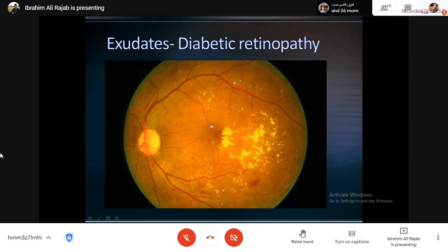We have 3 or 4 causes of dark macula. Thank you Amin. Because there is a high concentration of photoreceptors here, and there are pigments called lutein and zeaxanthin here, and because of the retinal pigment epithelium, a layer in the retina.